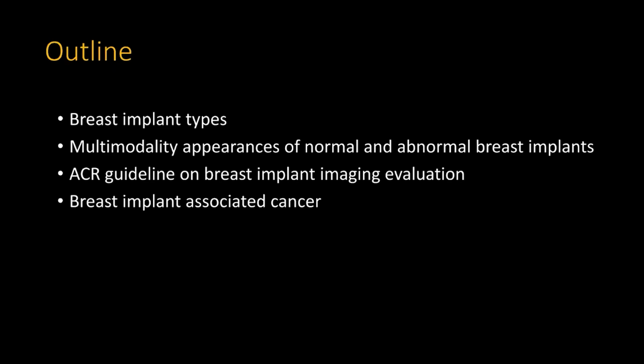I'm going to use a lot of questions to go over the cases to present the breast implant integrity evaluation, because I believe that is a very active and efficient way to learn, for me and also for my residents.